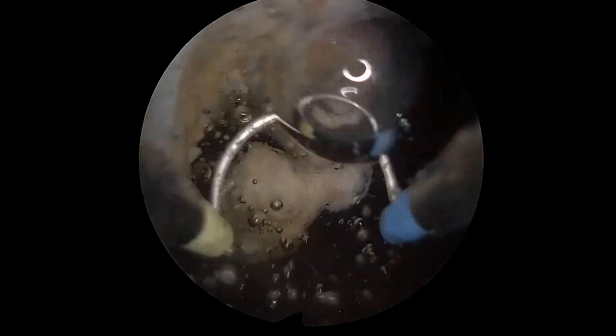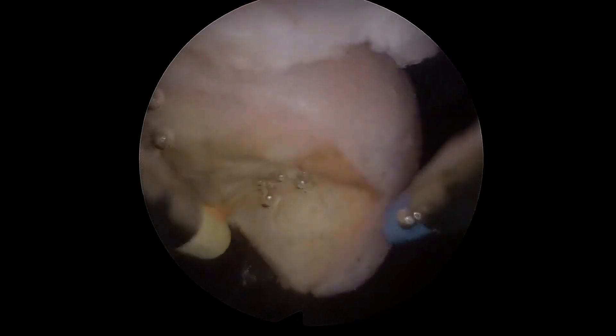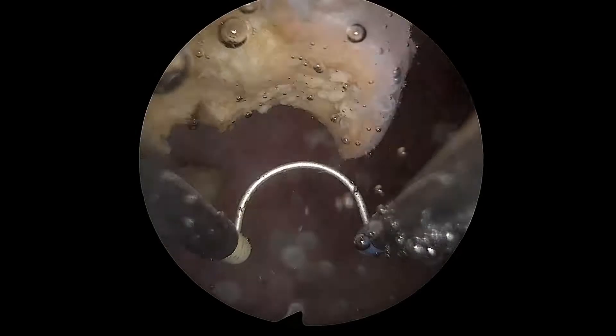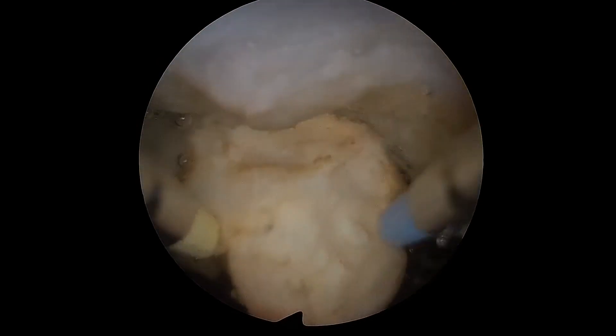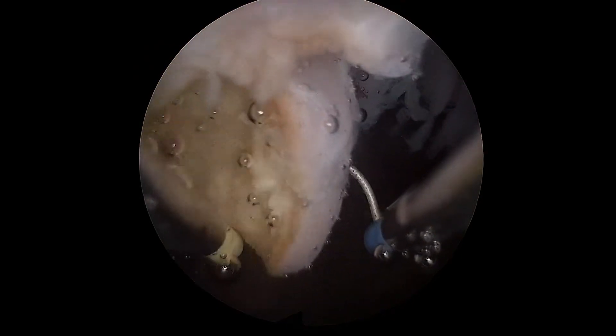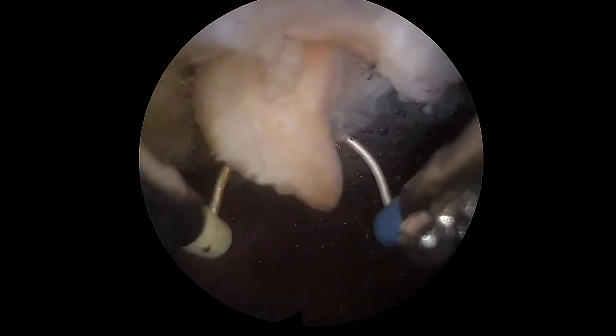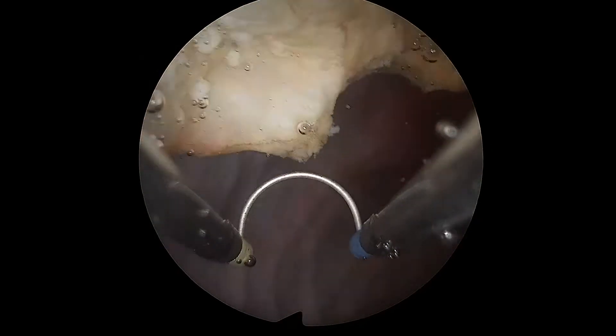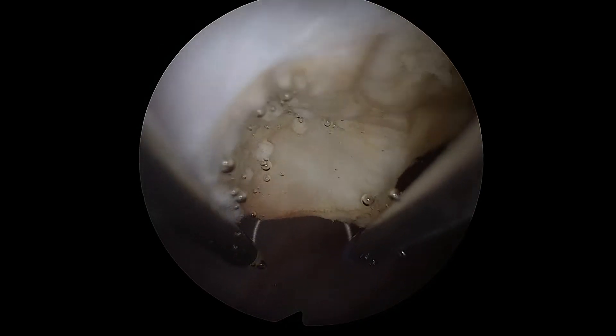This hysteroscopic myomectomy model can be constructed to provide polyps or fibroids of any size placed at any endometrial surface location. For example, an easy posterior wall placement, or, as is represented here, a more challenging anterior wall placement just distal to the inner os of the cervix.